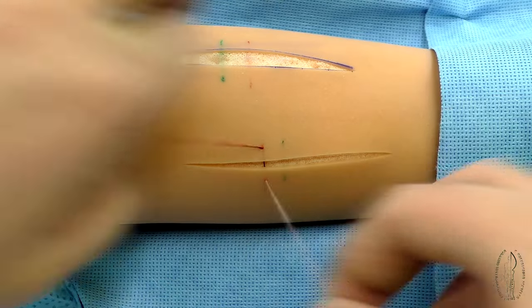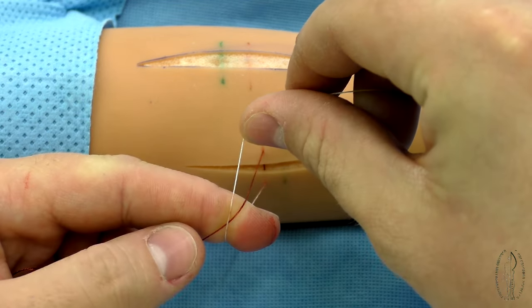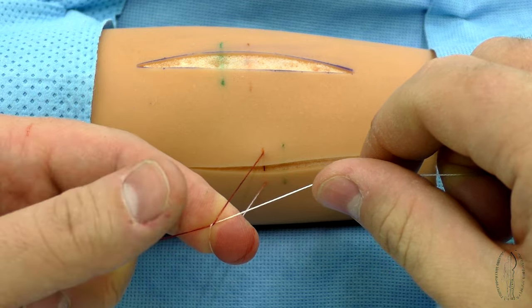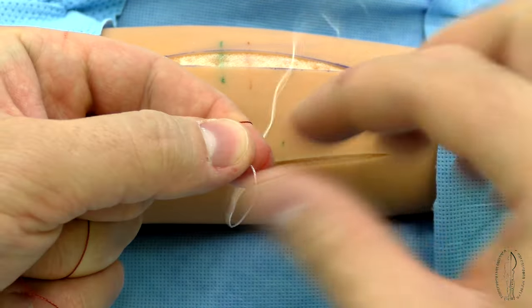The surgical knot differs from the simple one by the first loop being double. The ends of filaments are fixed as at the making of the simple knot, and then the primary double loop is formed by two consecutive interlacings of filaments.